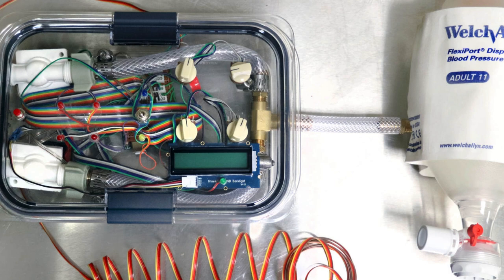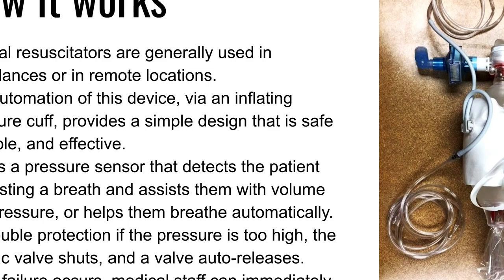The way that we built our own ventilator was by automating an Ambu bag — by putting a blood pressure cuff and using the air and the vacuum from each of the patients' rooms, and oscillating it with two actuators: PVC valves and an Arduino microcontroller. These types of manual resuscitators, known as the Ambu bag, are generally located in ambulances or remote locations.